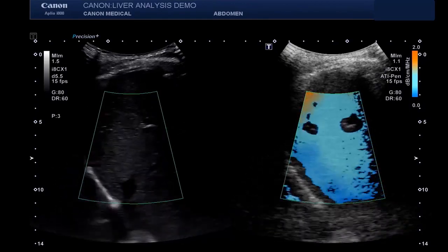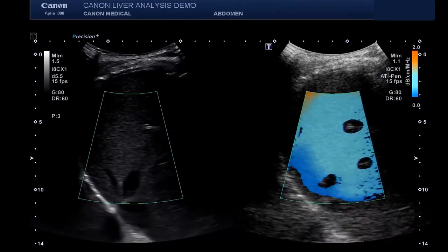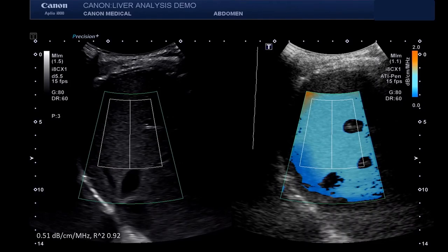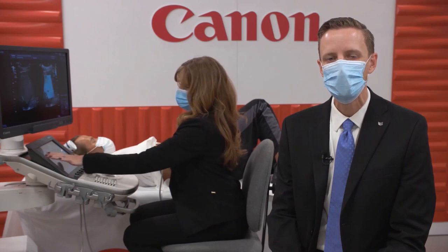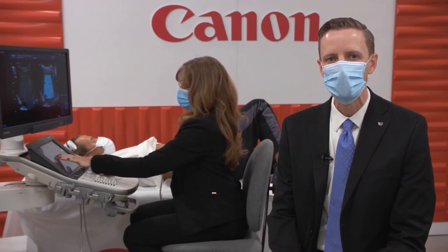When you're ready to quantify the attenuation imaging results, simply press the freeze button and your measurement ROI box will automatically appear. Place the measurement sample avoiding large vessels, artifacts in the subcapsular region, and areas of weak signal. Attenuation imaging can be performed quickly and easily, often only needing one to two minutes to complete your assessment for liver steatosis. And the great news is that we can now offer attenuation imaging on both the Aplio i-Series and Aplio A-Series systems.